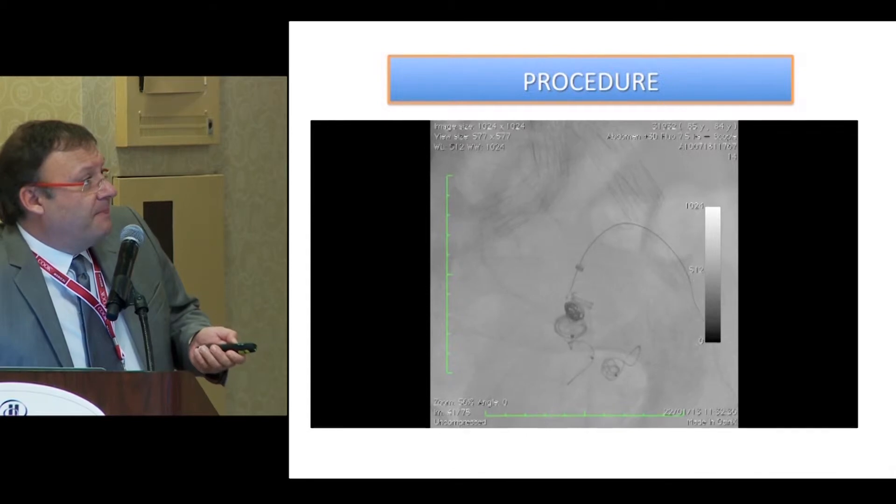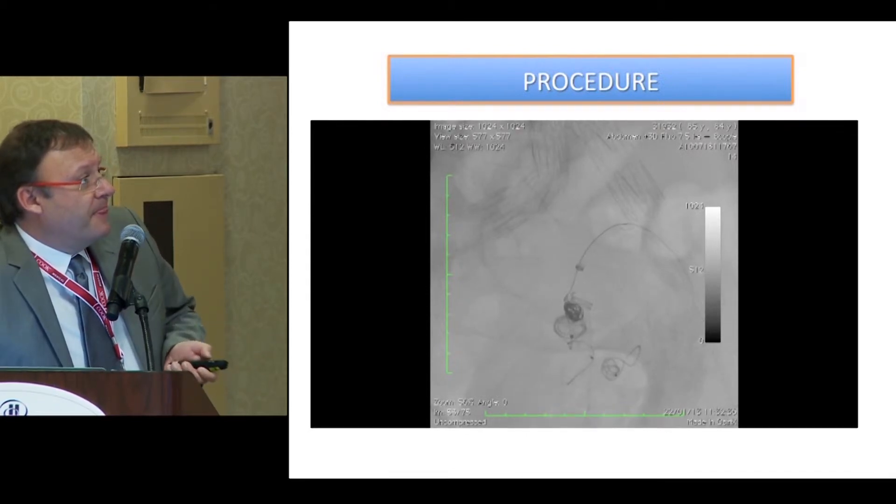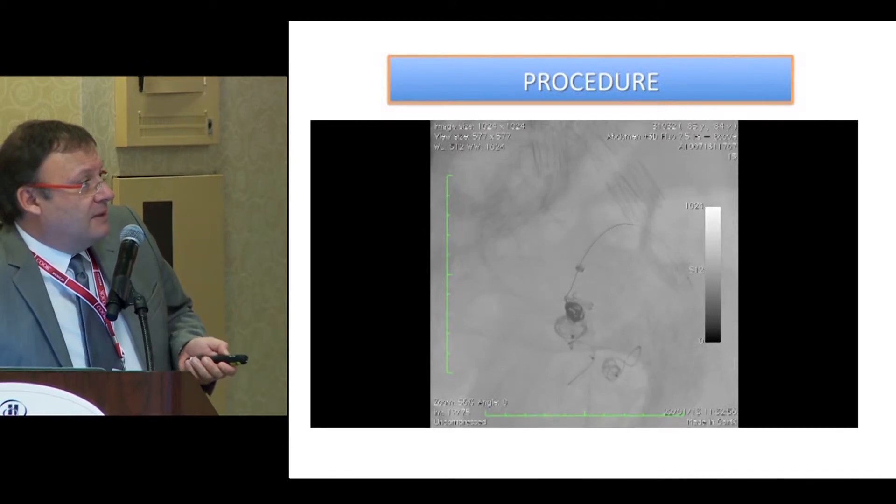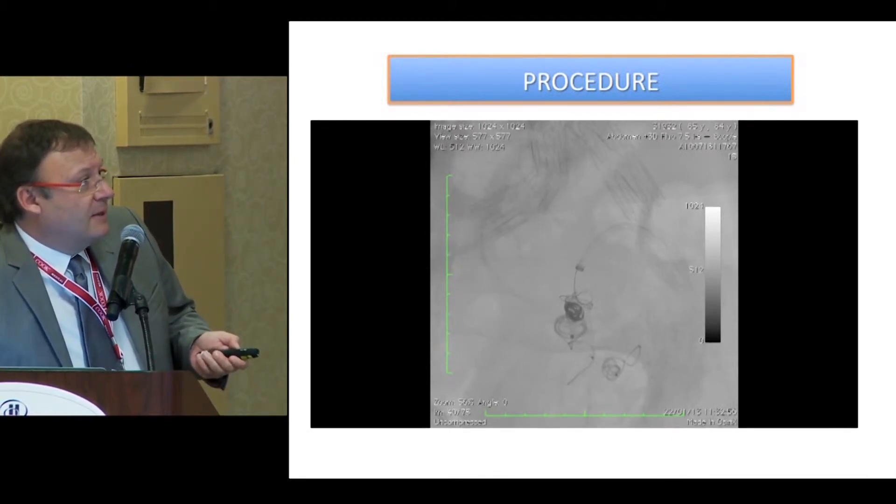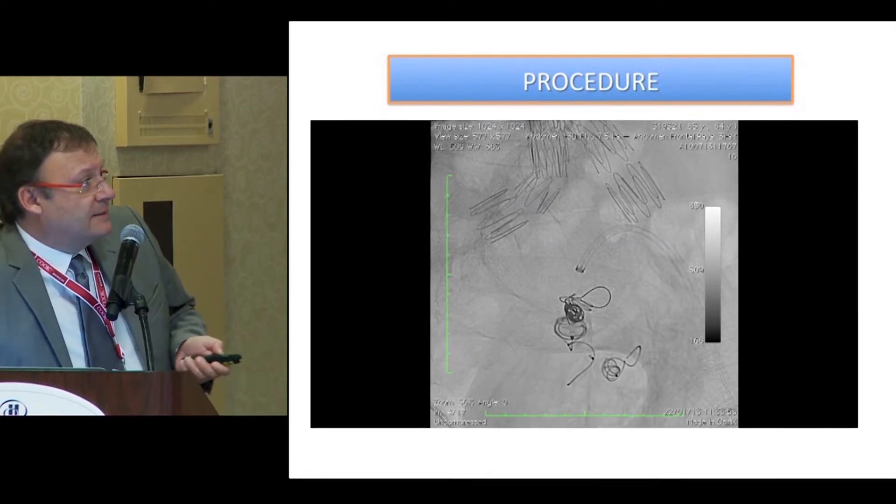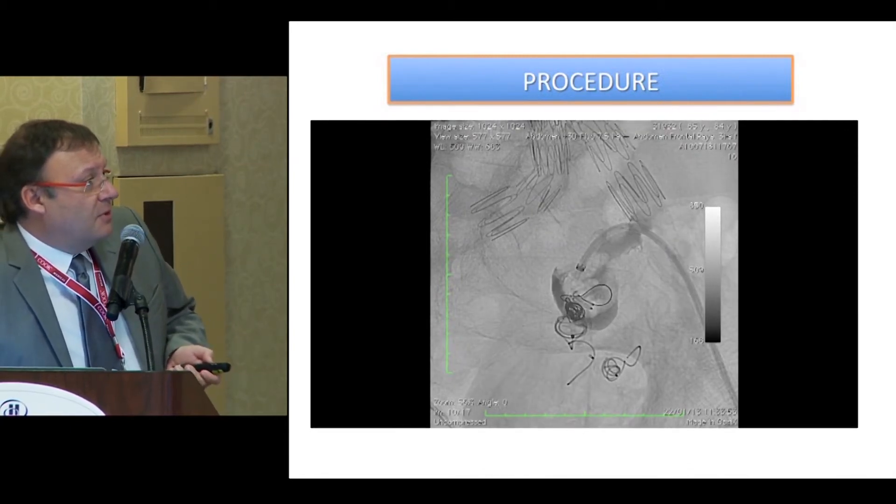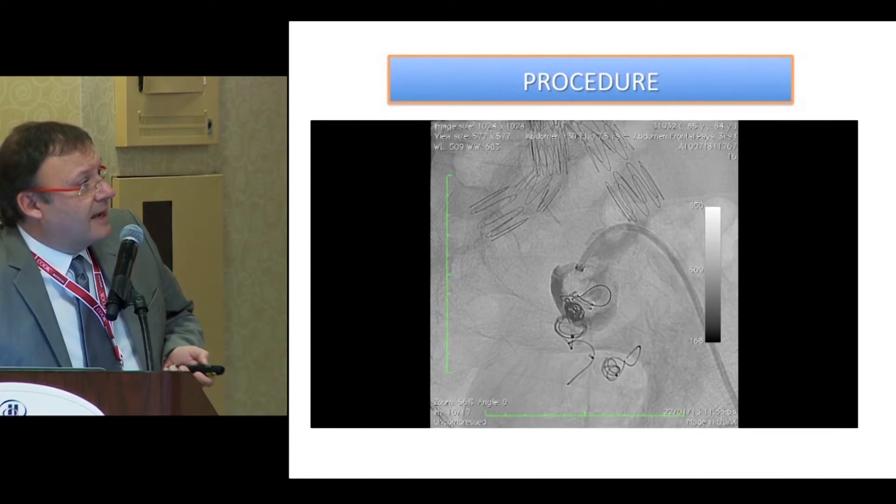We had very stable distal perfusion, and we used a microcatheter in order to pass Boston coils and to fill the sack.